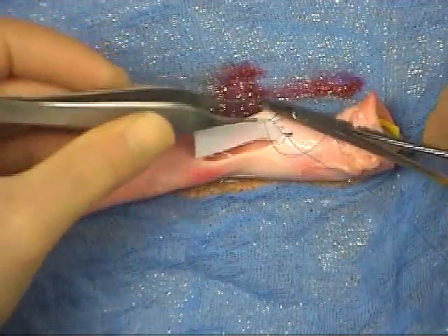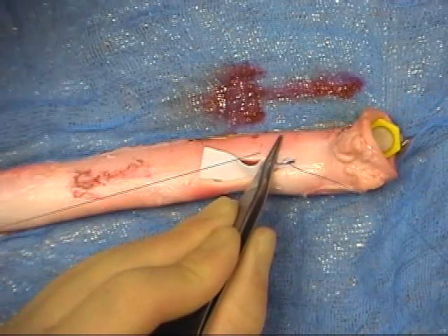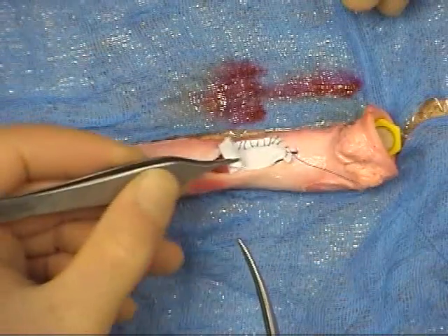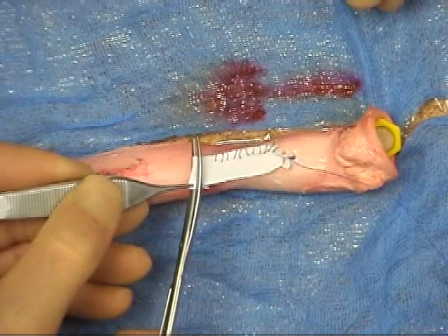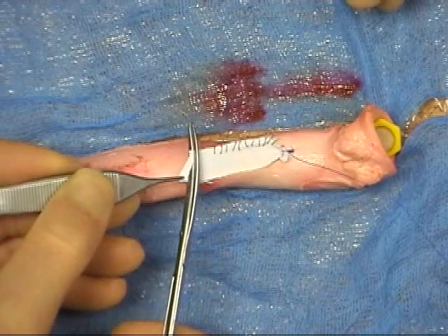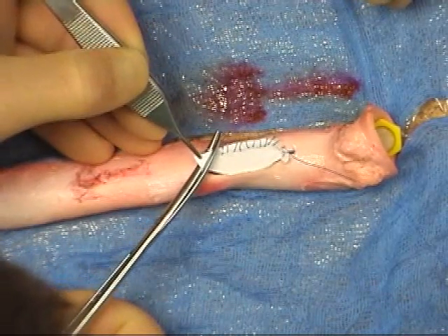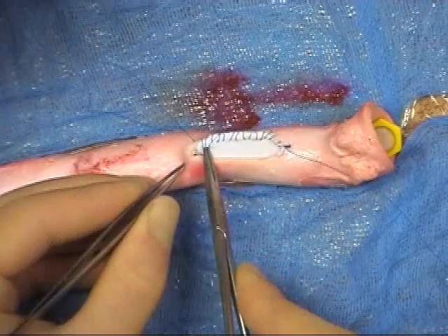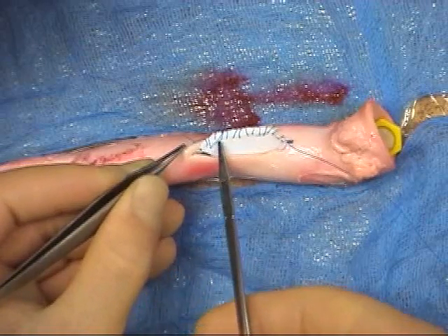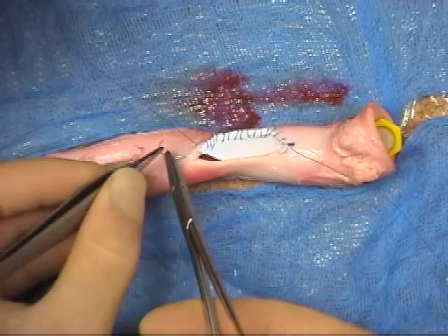Once a few sutures are in place, a small ridge will form between graft and vessel wall. It is then possible to place sutures through and through, pulling the thread down along the line of the vessel to bring up the tension, and then handing it to the assistant. As the distal end of the opening is approached, the size of the graft should be checked and adjusted as shown. This should always be done as the graft is sutured in place, and not at the start of the procedure.